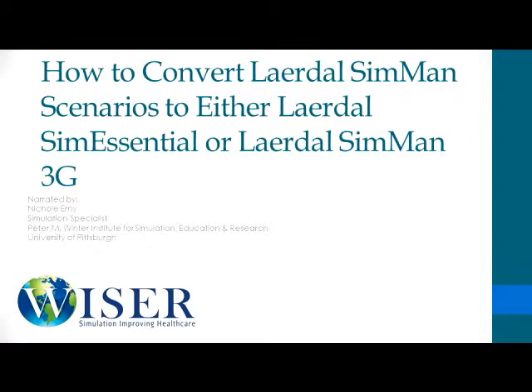Today I will show you how to convert a preprogrammed scenario from the Leradol SimMan platform to the Leradol SimEssential or Leradol SimMan 3G platform.